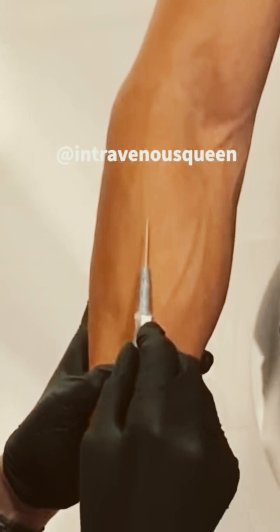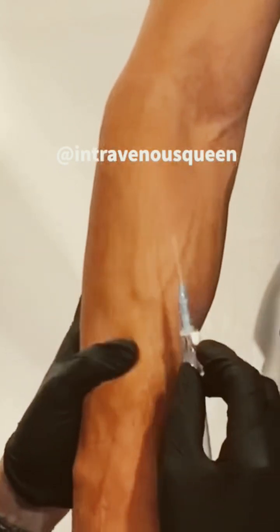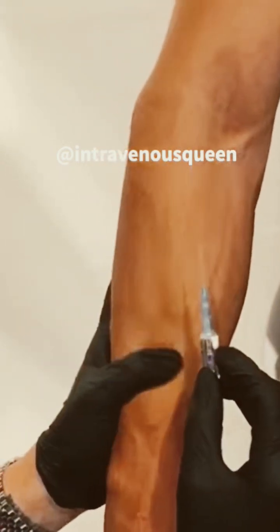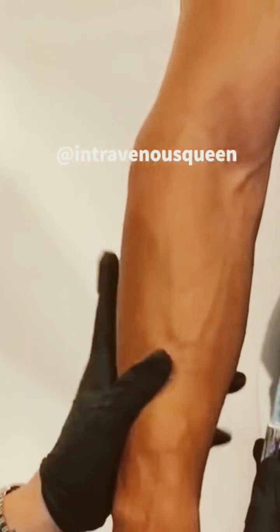Another important maneuver shown in this video is the use of my left thumb. By using my left thumb, I pull down the skin and straighten out the vein so that the vein doesn't try to move or roll on me.